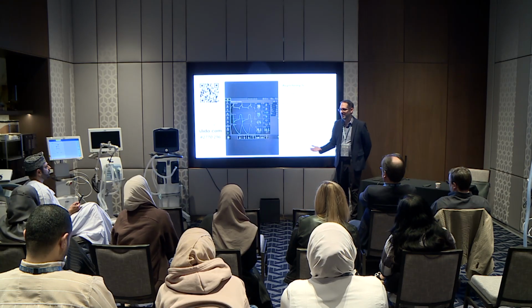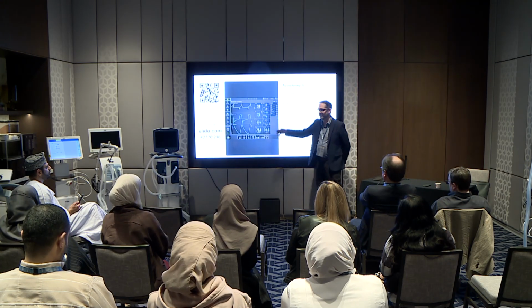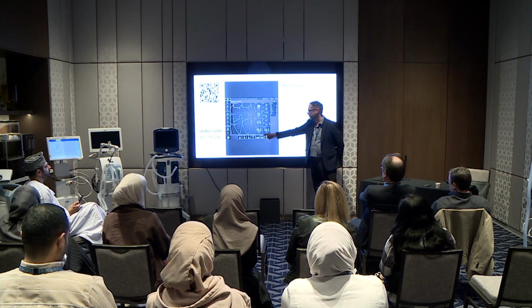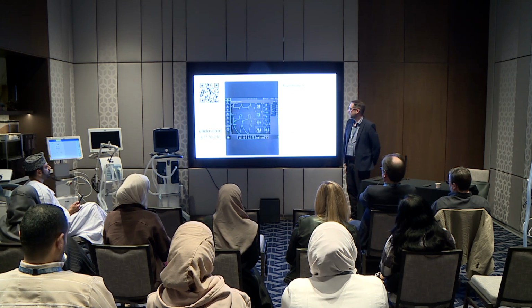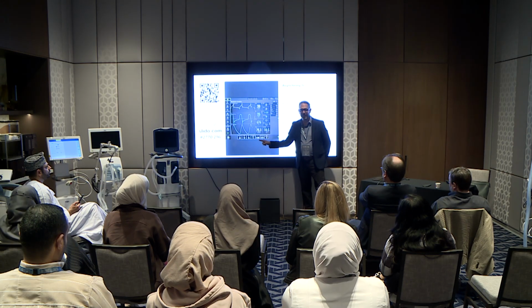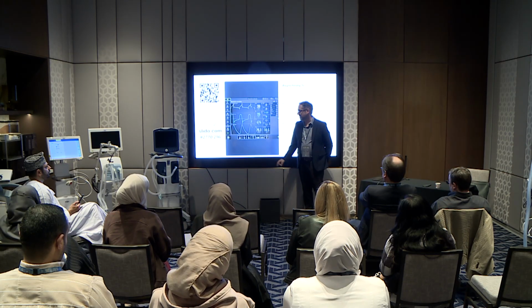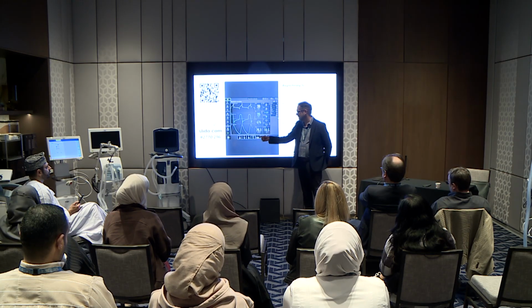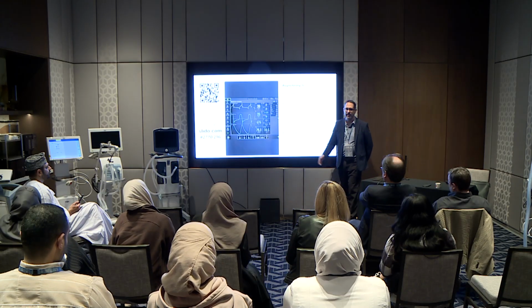If this was any other patient, and I told you that we tried to do that, and the tidal volumes were over 12 mils per kilo on pressure control of 10, it was crazy. The dynamic compliance of this patient is 75, so a change of 1 centimeter of water will raise tidal volume by 75 mils. So if you give 4 centimeters of water, it's 4 times this, over 300 mils on top of the breath. So she would have got like 900 or 1,000.